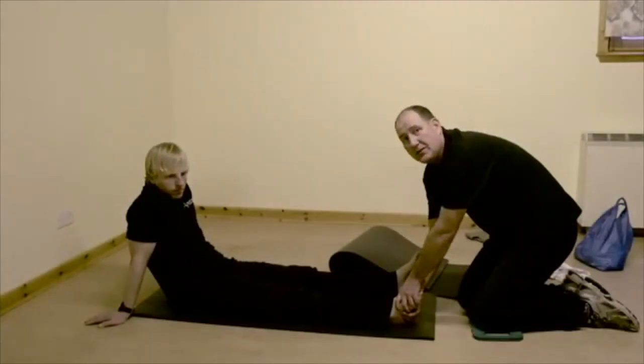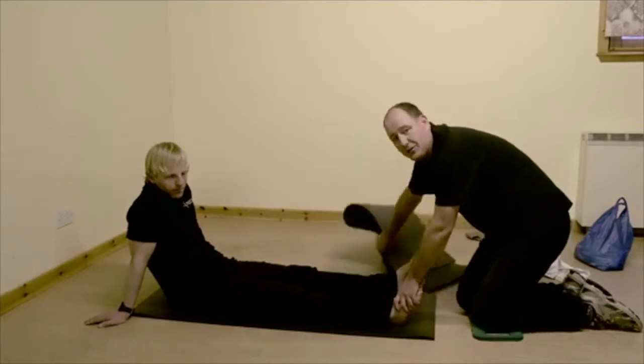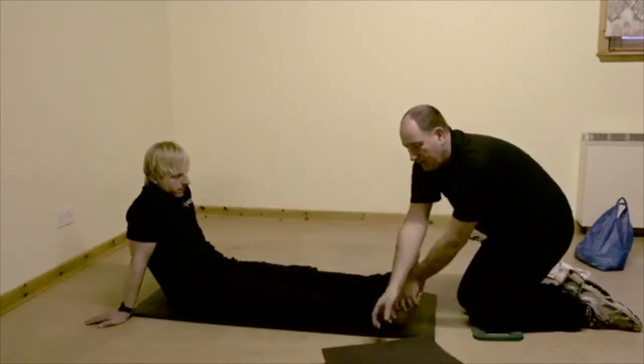So now we're going to show you a couple of alternative techniques for keeping the relocated leg straight. We've straightened Tom's leg and luckily I have a carry mat here which we can use to help to keep it straight.